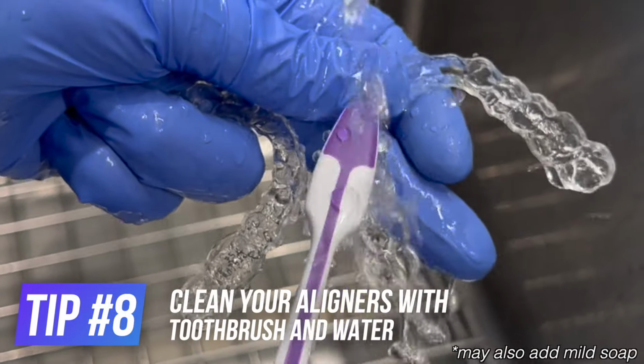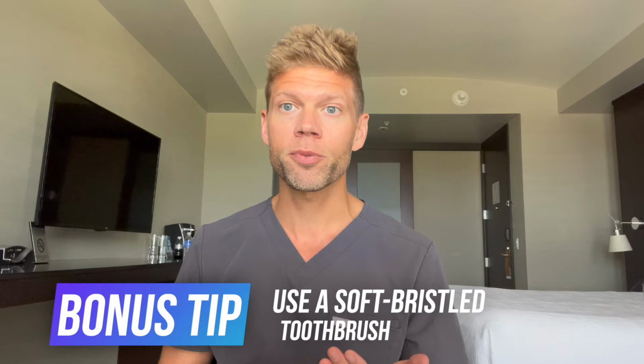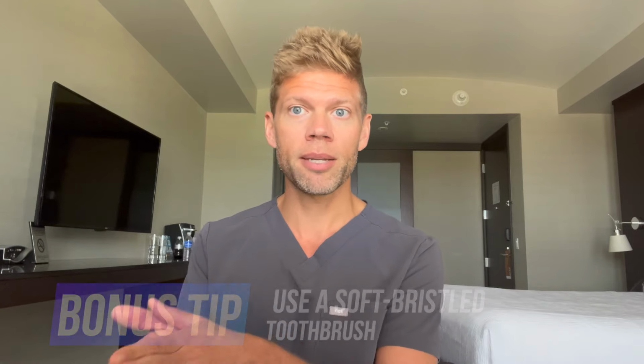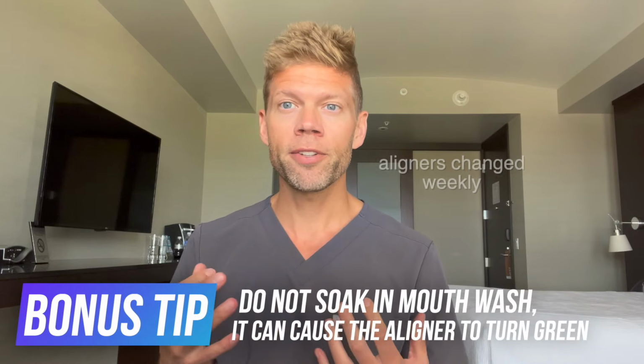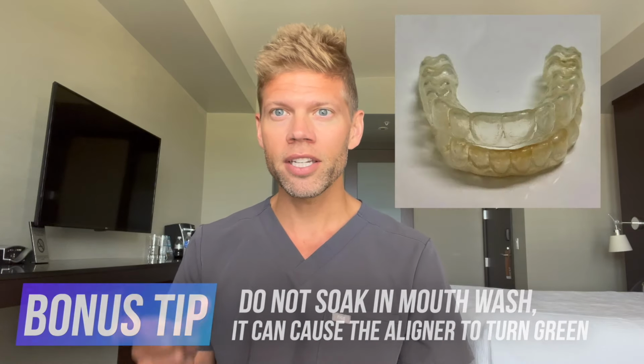Most of the time, a toothbrush and water just on the inside surface of the aligner should be enough, and whenever you brush your teeth, just brush your aligner as well. You can use certain types of either aligner tablets or cleaners or denture cleaners, but the good news is that you're switching these out weekly. Even if you get to the point where your aligner starts to get a little dirty or discolored, you're moving to the next aligner soon. So don't worry about it too much.